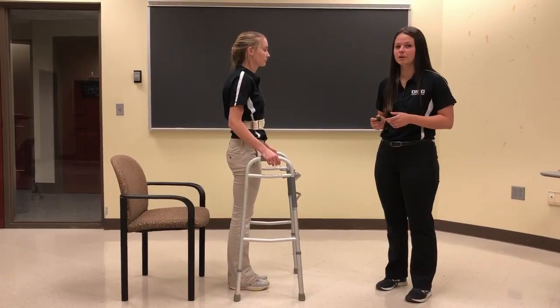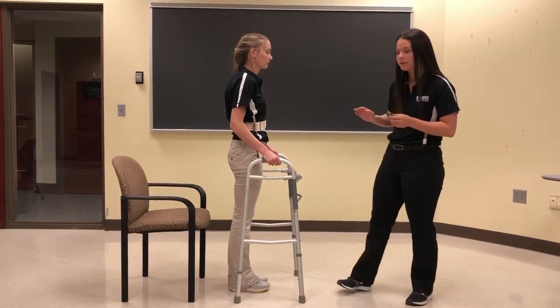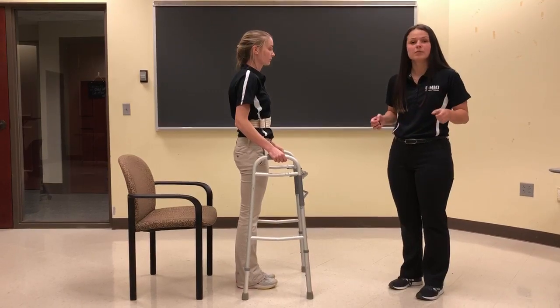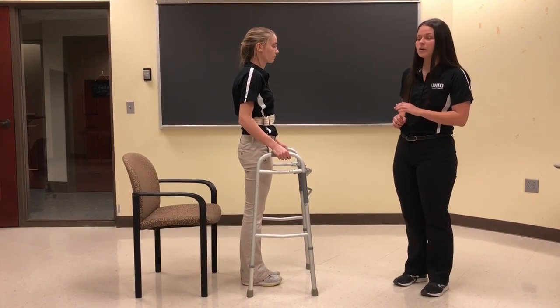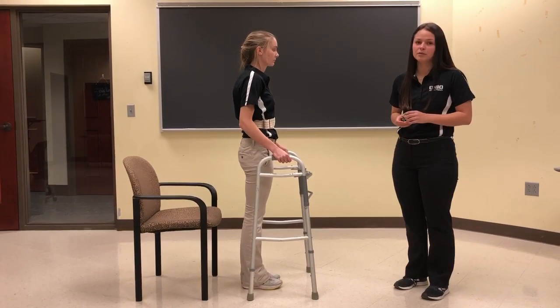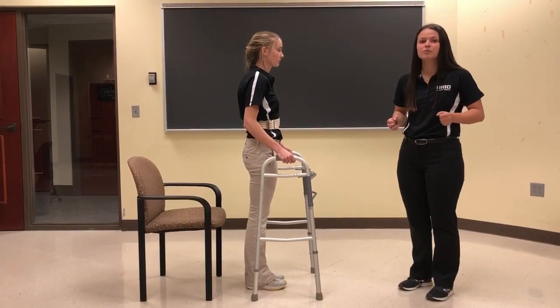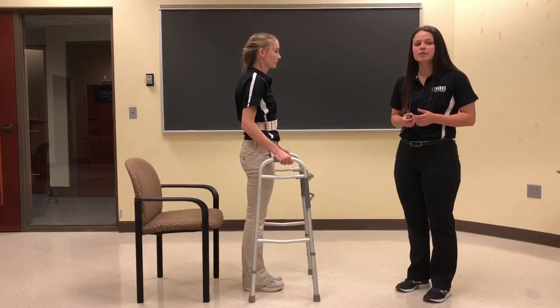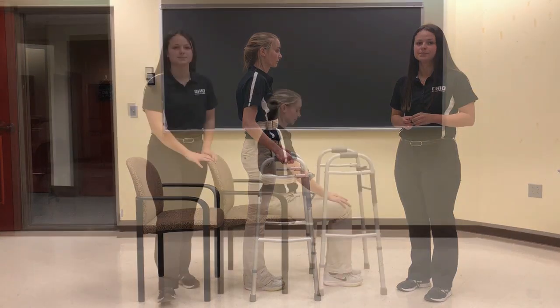To confirm the fit of the walker, you need to ensure that the patient's greater trochanter is aligned with the hand grips of the walker. You will also have your patient put their hands on the hand grips of the walker and ensure that their elbows are flexed to about 20 to 30 degrees. If the patient has trouble fully extending their elbows or they need to flex their back when standing or walking, the walker is either too high or too low.